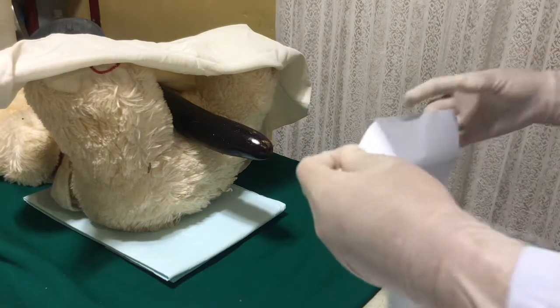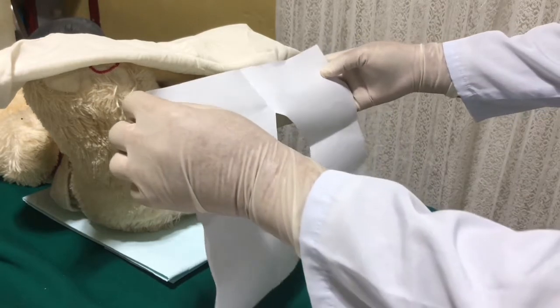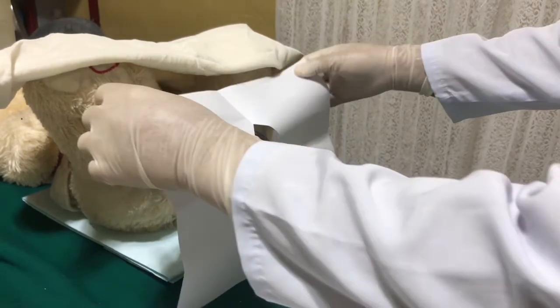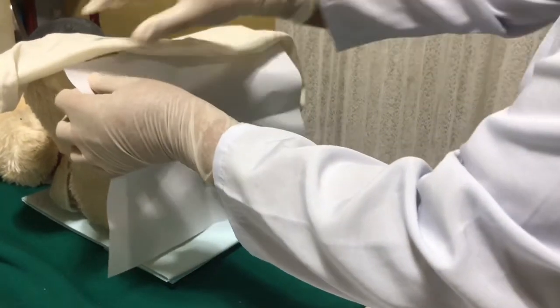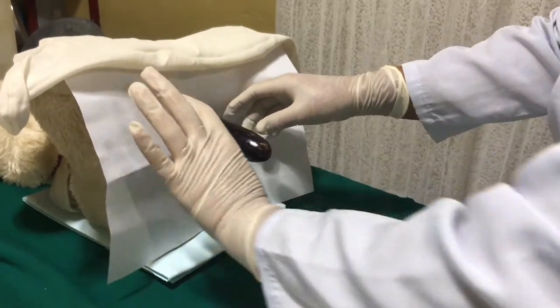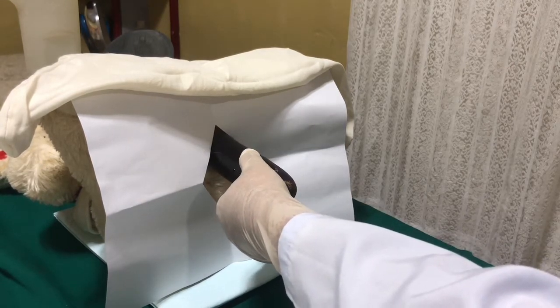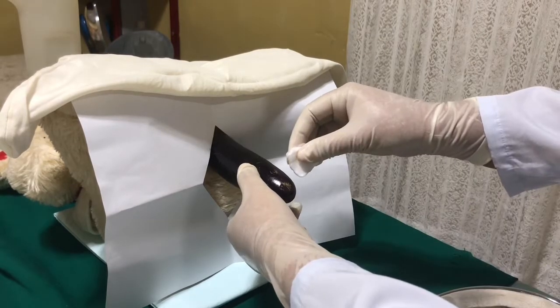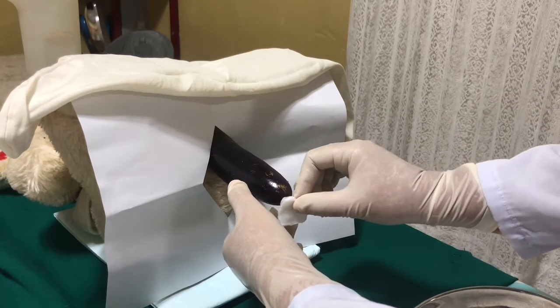Grasp the upper corner of the fenestrated or eye drape and unfold it. Place the fenestrated drape aseptically over the perineal area with the penis extending through the opening. Holding the penis with the non-dominant hand, disinfect the meatus twice using cotton balls with betadine antiseptic solution. Starting from the top, use a circular motion stroke, then downward for each cotton ball and discard.